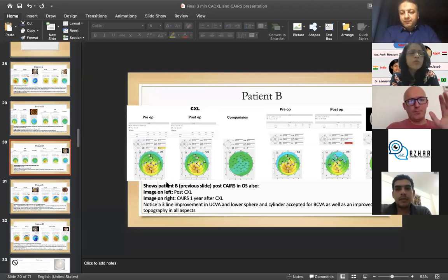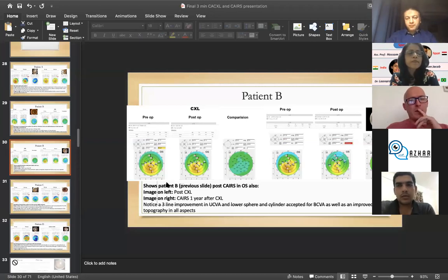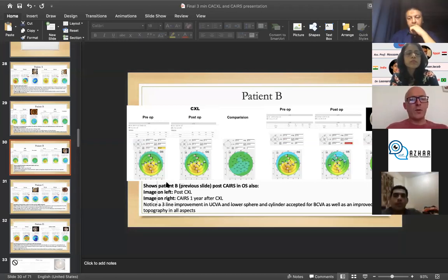Yes, Leonardo. About the treatment of PMD, I'd like just to comment about the results of synthetic intrastromal corneal ring segments. We have to differentiate a real PMD, where you usually have a thinning in an optical zone of 8 millimeters, from a PMD-like. Most cases of crab claw configuration are actually PMD-like and not real PMD.